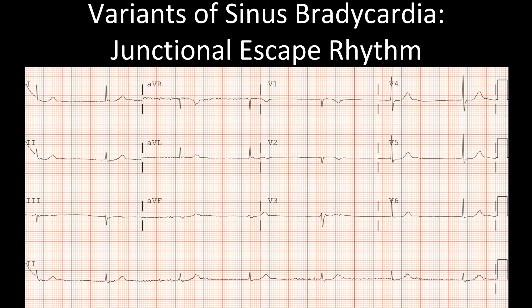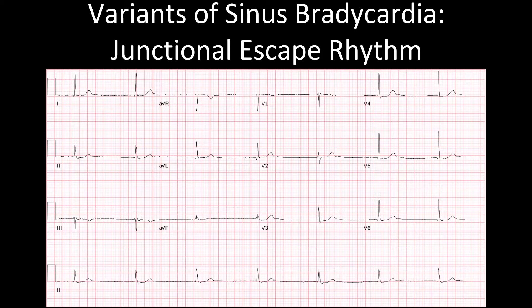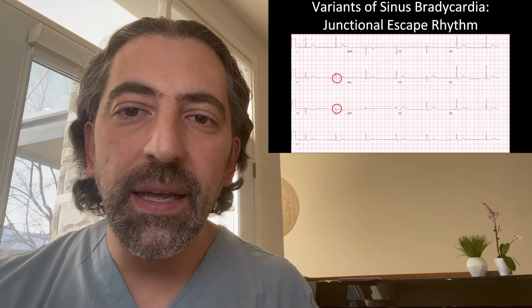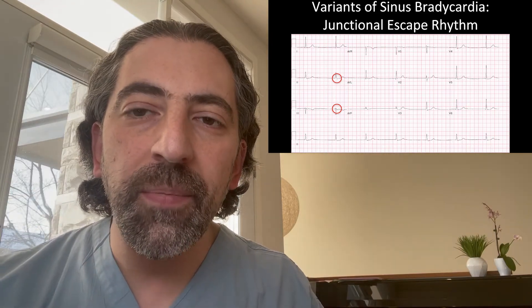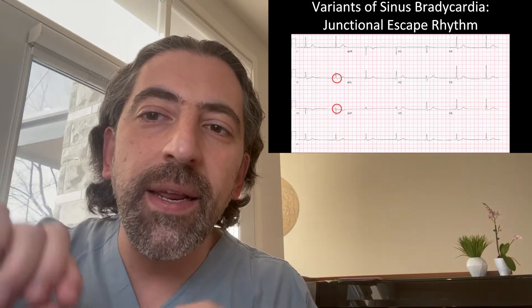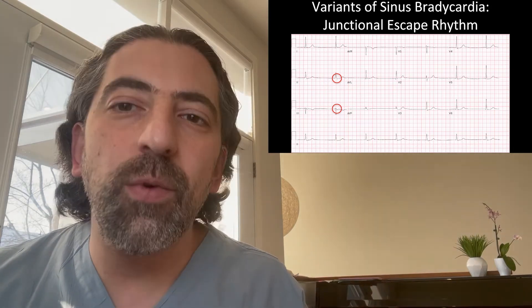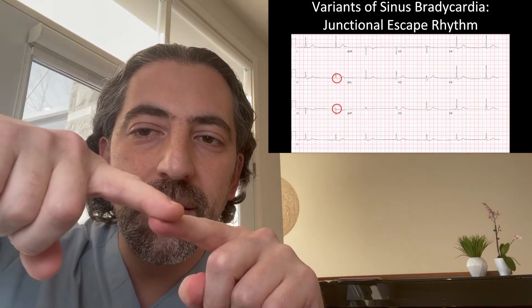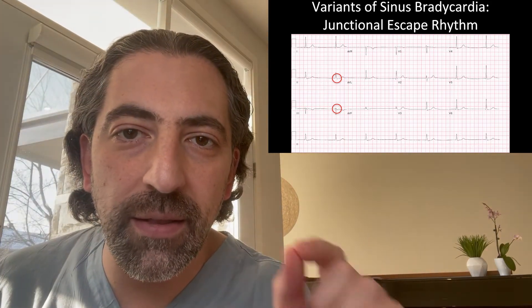Sometimes, instead of another part of the atrium taking over, the AV node will take over, giving you a regular escape without a preceding P-wave. This is called a junctional escape rhythm. Here's an example of a junctional escape rhythm where you see the absence of P-waves preceding the QRS complex. In another example, you actually see the P-wave overlapping or slightly after the QRS complex. What's happening is that the AV node leads depolarization, conducting down the ventricles to generate a QRS and conducting up the atria to generate a negative P-wave. So the P-wave and QRS are generated at the same time because depolarization is initiated at the AV node.